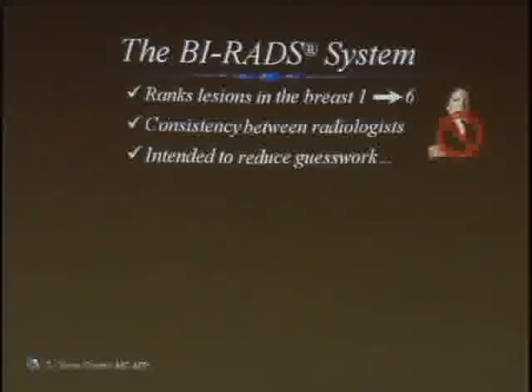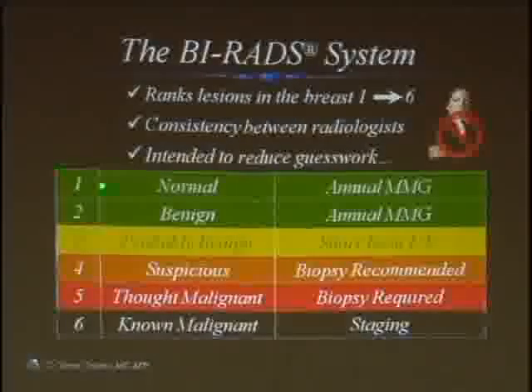Doesn't matter how many different flowery words I use to describe it. The bottom line is, in my summary, I say BI-RADS something, and you know what to do with it. This is the chart. Remember, there is a BI-RADS 0, which means incomplete. Namely, I think this is a BI-RADS 0, we need to do this to figure out which one of these it is. The scoring is simple.